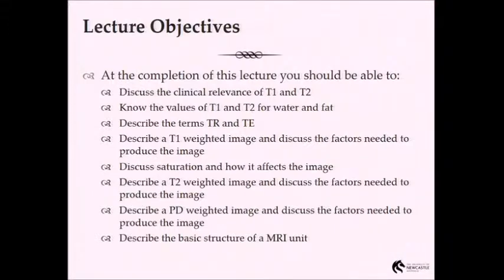What we call clinical MRI scanning, or putting someone inside an MR scan and producing medical images, really has its origins from what is referred to as NMR, nuclear magnetic resonance. The phenomenon was described in the late 1940s, and it took from that time to the 80s and 90s for it to go from something they did in chemistry labs to something they could do in humans. The reason I'm telling you this is that doing a true T1 image would just not be feasible in clinical mode. It would take too long. We can't stick patients inside magnets for that amount of time.